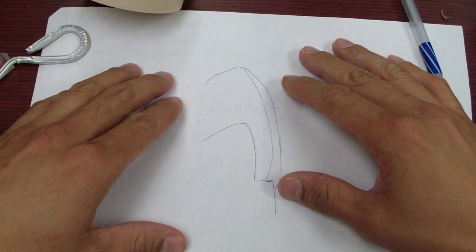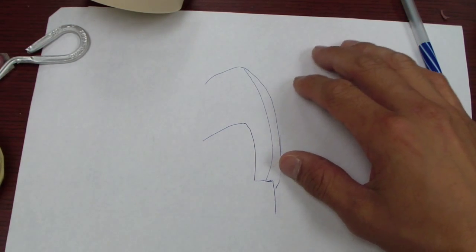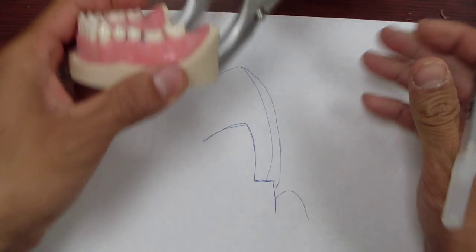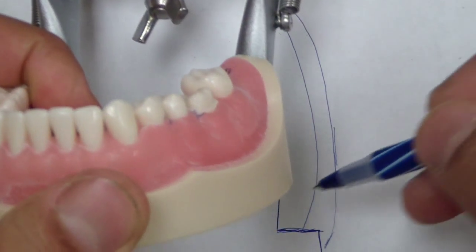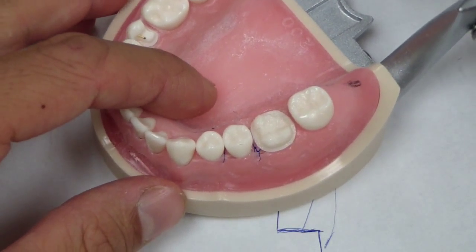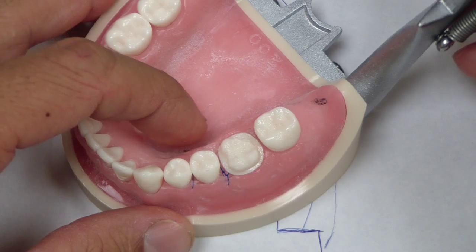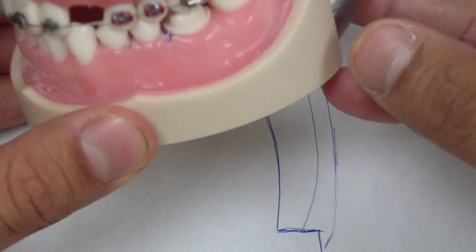Now let's briefly discuss provisional restorations for term crowns. If this is your preparation finish line at the gingival margin, I've prepared the tooth for the impending restoration, and during the preparation the old amalgam fractured off — which is fairly common and replicates reality pretty closely. It looks kind of glossy because there's a separating medium here so that when you go to fabricate the provisional restoration on the die form it doesn't stick to it.